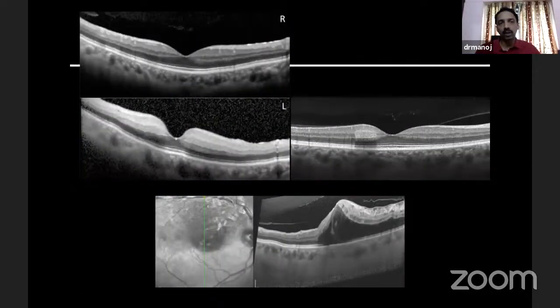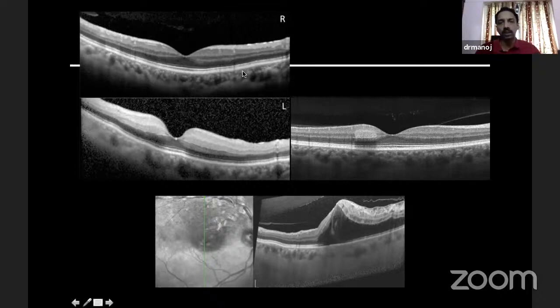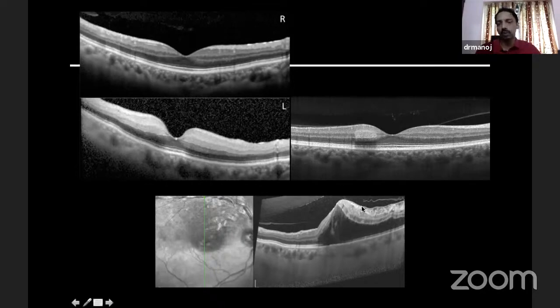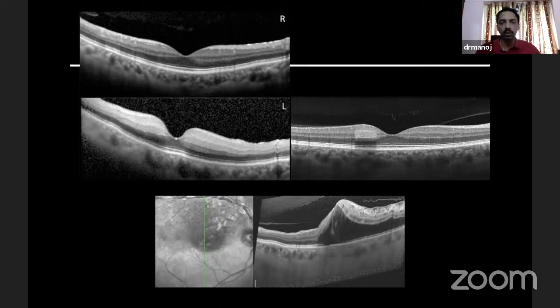The next thing is to look at the middle or inner layers of the retina and look at the reflectivity within these layers. Normally, you see these lines of reflectivity — hypo and hyperreflective lines. But when the inner retina is totally replaced by increased reflectivity, you are probably dealing with a vascular entity — it could be arterial occlusion or venous occlusion, in which case you often have a lot of fluid underneath. Also, sometimes you can get focal areas of reflectivity — this is called paracentral acute middle maculopathy (PAMM), which is again a vascular event.